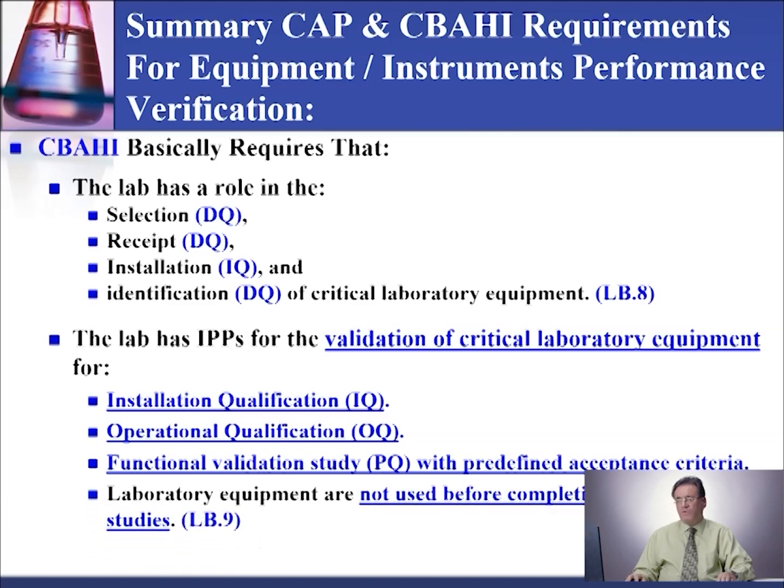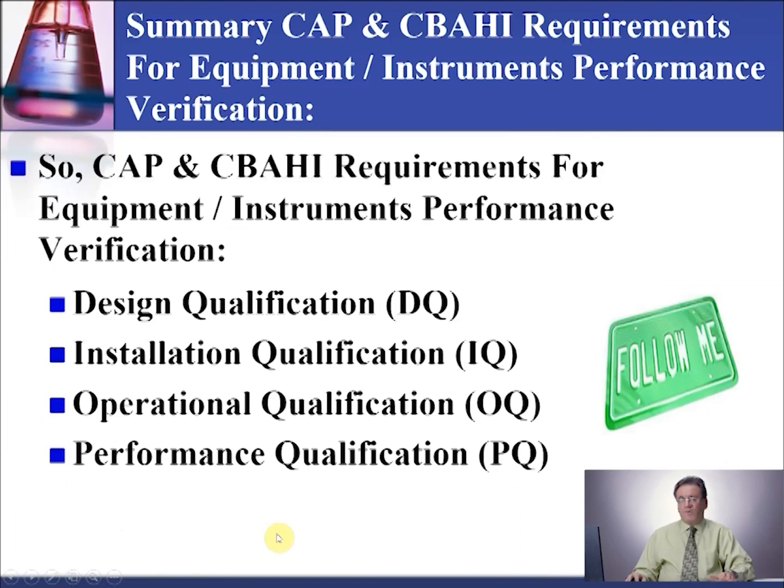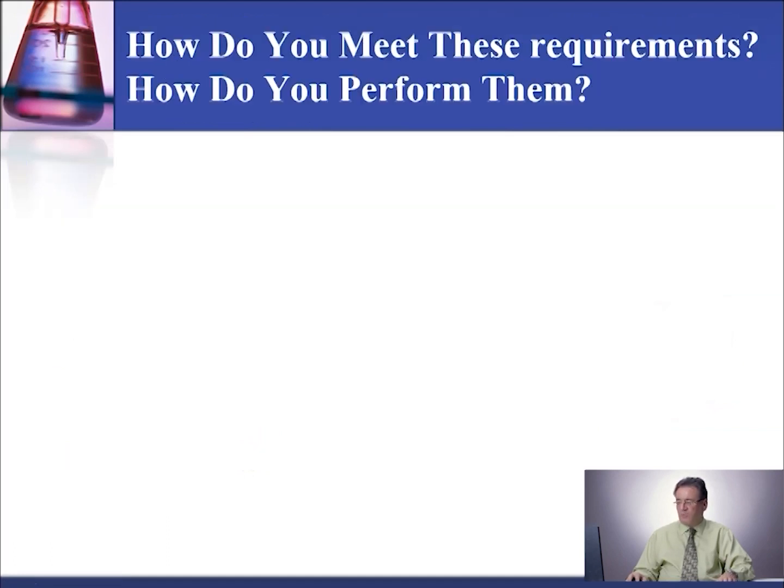When you are done with this step, you will be able to use the instrument for patient testing. Consistency is important in performance qualification. The test frequency is much higher than in the operational qualification. The PQ should always be performed under conditions simulating routine sample analysis.